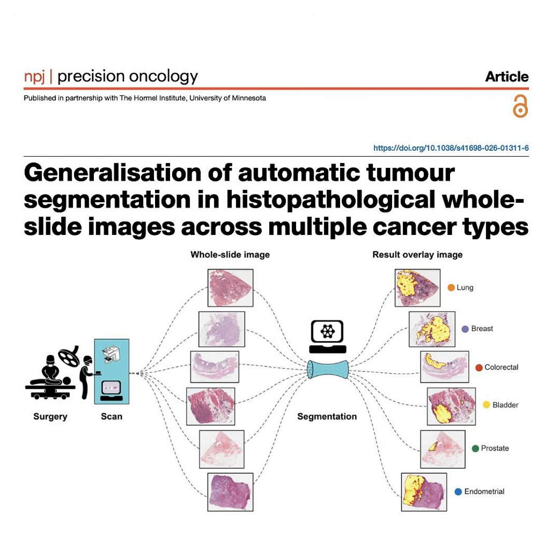Okay, let's contextualize MedSam for you listening. That is the medical segment anything model. Right. It's essentially a massive general-purpose AI for medical images that usually requires a human to draw a bounding box around a region of interest just to prompt it.